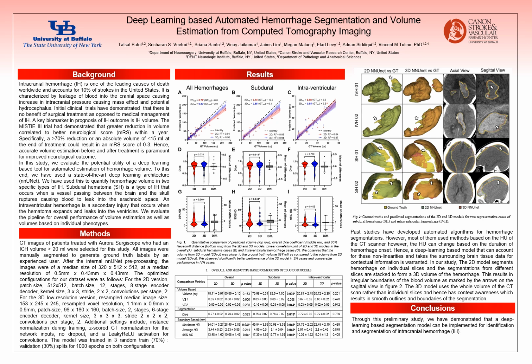The first one was based on 2D slices because a CT scan is traditionally made up of a bunch of 2D slices stacked together. So the first model that we evaluated was 2D slice-based segmentation, and then we stack all these segmentations to give us a 3D volume. And the second was a 3D convolutional neural network, which we use as our second model.